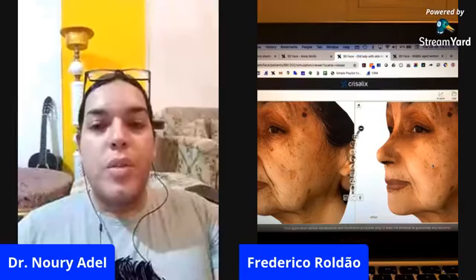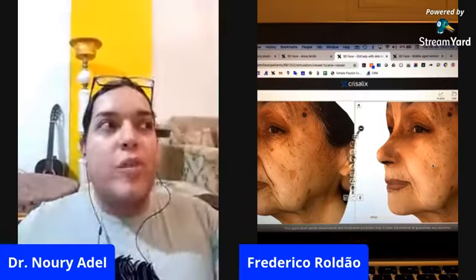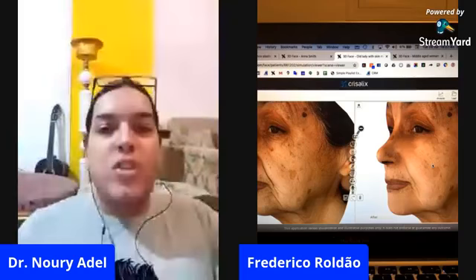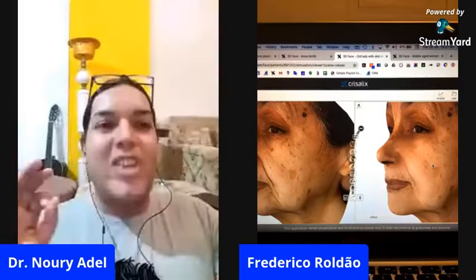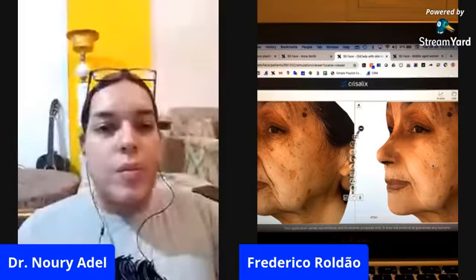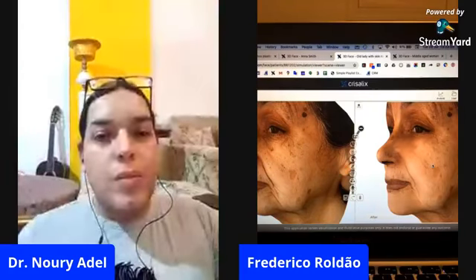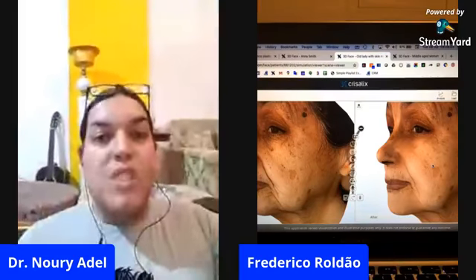I see. That's perfect. By the way, I want to ask about something. Sometimes when you do some measures on the software, and when you try to apply those measures on the real patient face, there is a magnification factor or some calculation that you should be doing. Does the same occur with your software, or is it very realistic, like the real measurement on the patient face? It is very realistic, and the margin of error is similar to the margin of error for human measurements, for when you measure by hand using a ruler or a caliper or something. And so it's very accurate and precise.